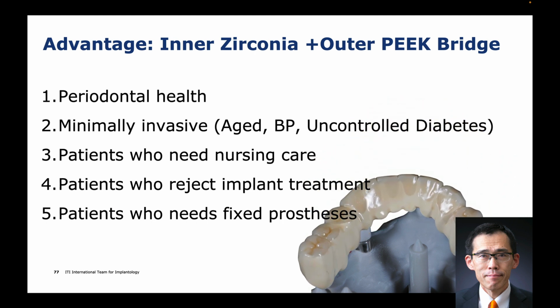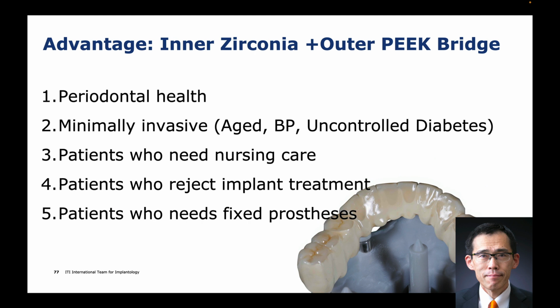And the advantages of this type of prosthesis, inner zirconia crown and outer PEEK bridge: First, periodontal health. Secondly, minimally invasive. Third, patients who need nursing care. Fourth, patients who reject implant treatment. Fifth, implant patients who need a fixed prosthesis.